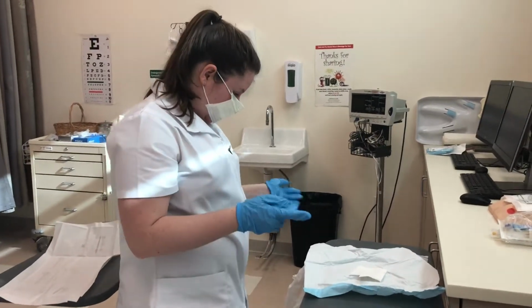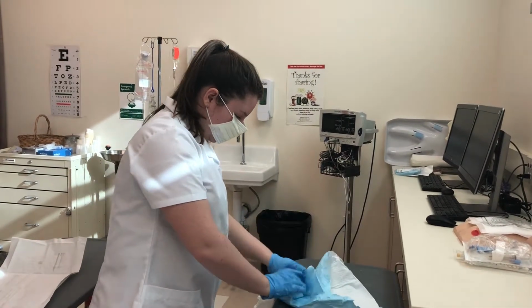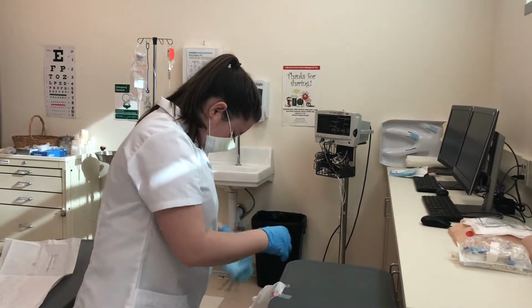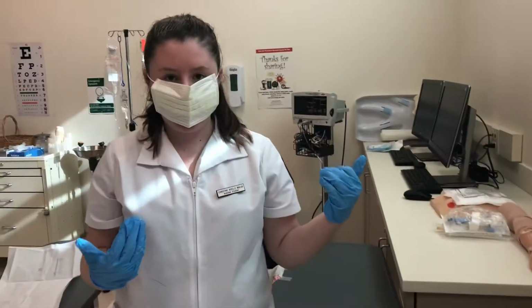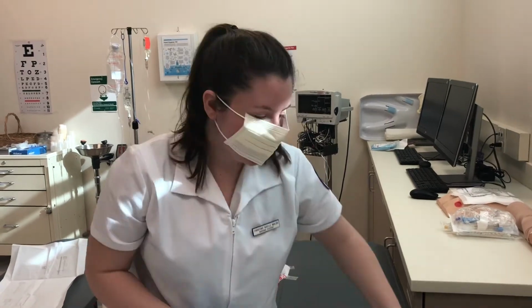And then the next thing I will do is wrap up my sterile field. I would clean up my area. I'm going to redress the patient, ask them if they're in any pain before I leave them. I'm going to bring the side rail back up.